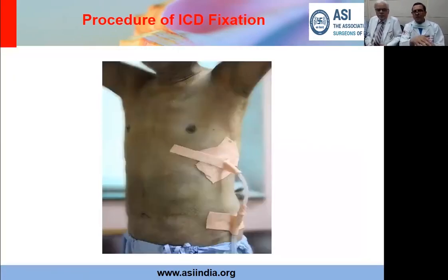Now, another important thing which we have learned along the way is that many times people used to have just this dressing and this tube hanging down connected to the bottle. Many times during shifting, etc., there is a pull that causes pain to the patient, and sometimes there could be inadvertent pulling out of the tube. So now we've started what we call secondary strapping, where we give a little loop of chest tube here and then another area where Dynaplast or plaster or something fixes it.